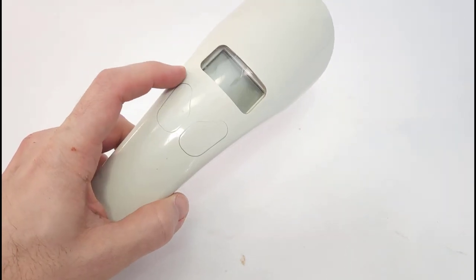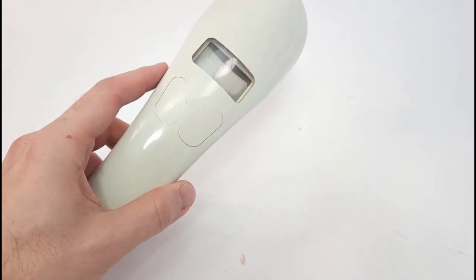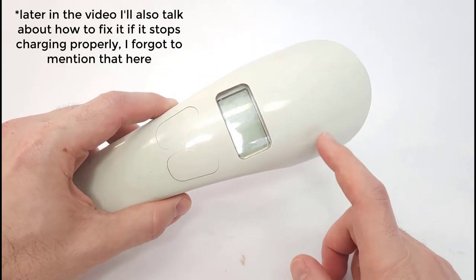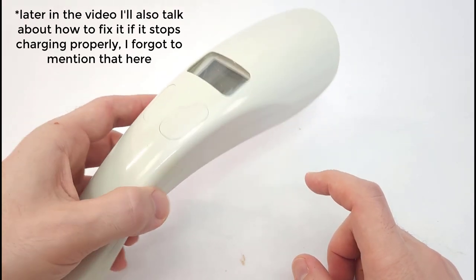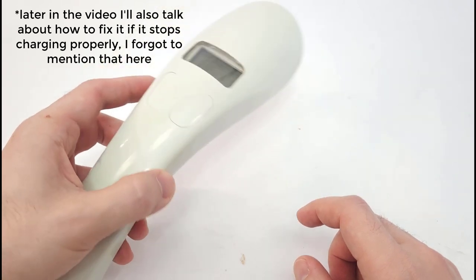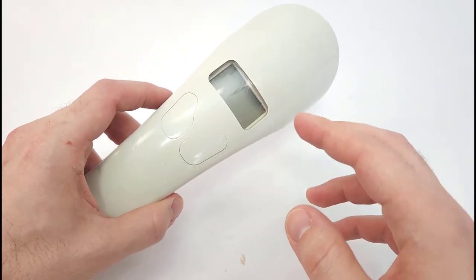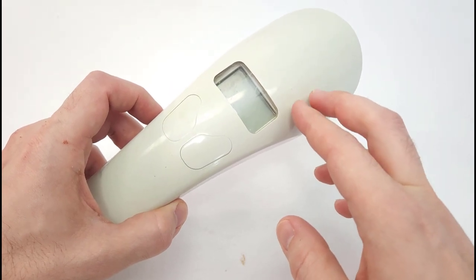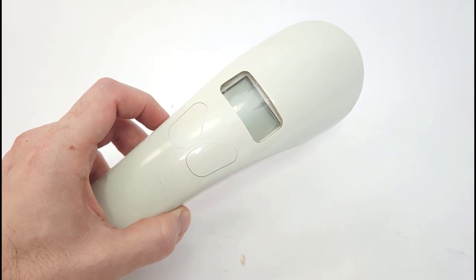And both times this happened, the device stopped working. My wife brought it home and I noticed that there was a rattling noise, so I figured something was loose inside, and it turns out that there is a critical part that is just held down by hot glue. Over years of use and picking these things up and putting them down, that part can eventually just get knocked loose and it will stop working. So in this video, I'm going to show you how to take this thing apart, fix the part that came loose, and then put it back together.